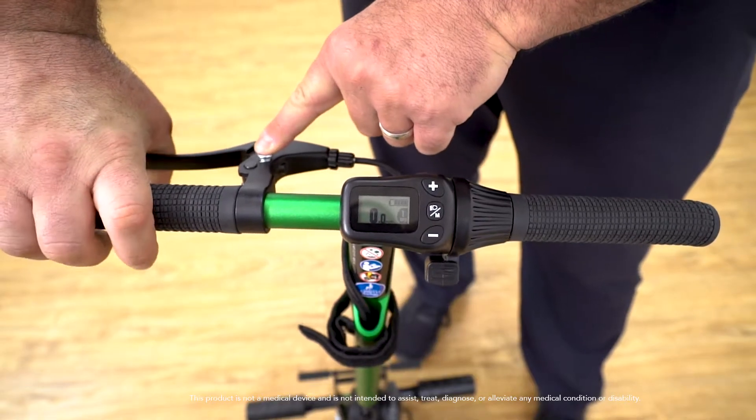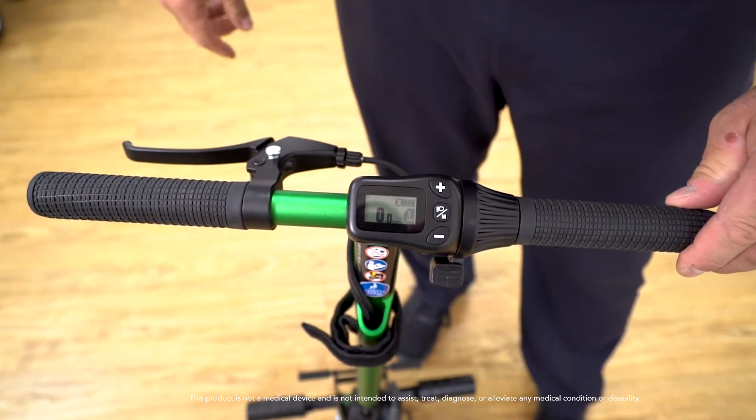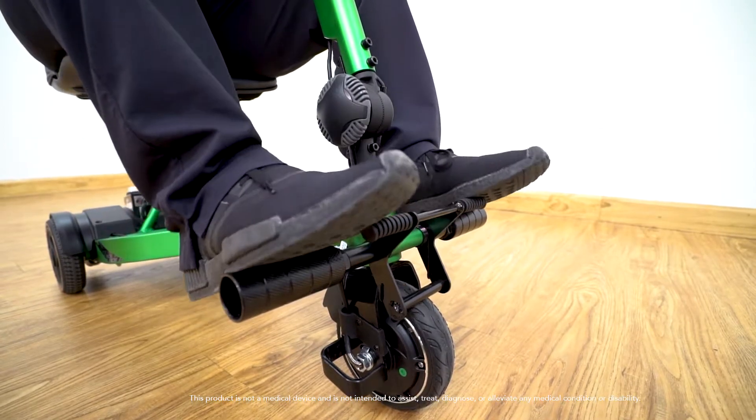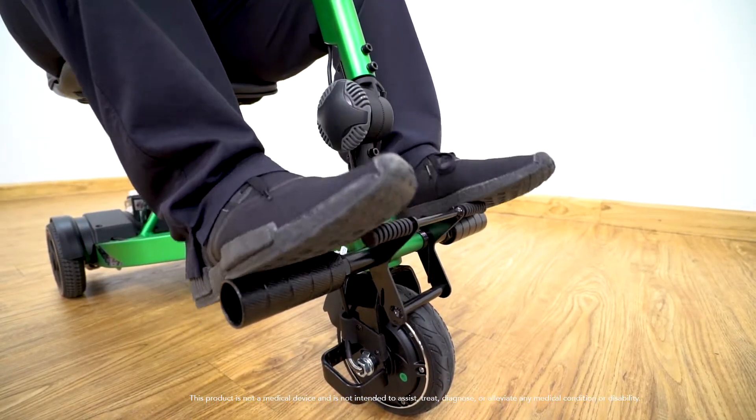You can also lock the brake in place by pushing down the silver pin. There is also a secondary foot brake. We recommend only using this foot brake when it is absolutely necessary.